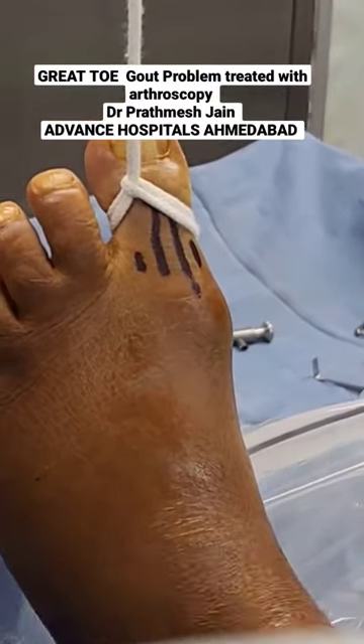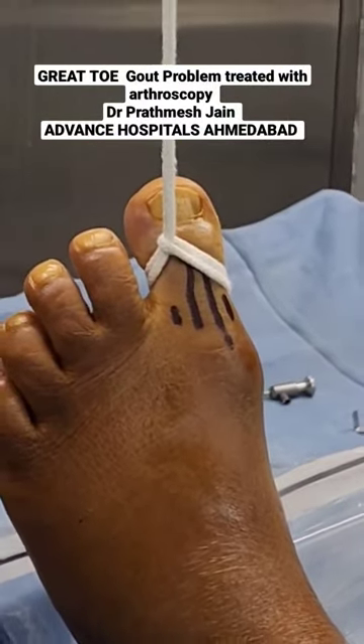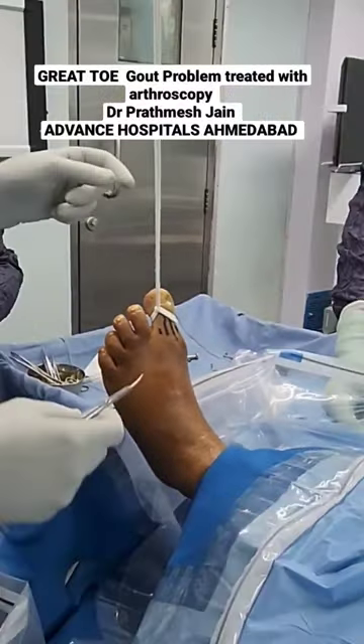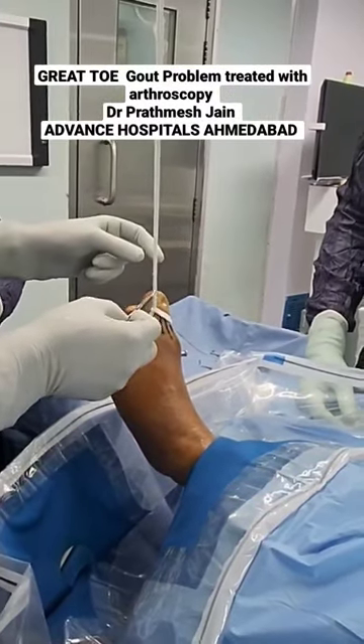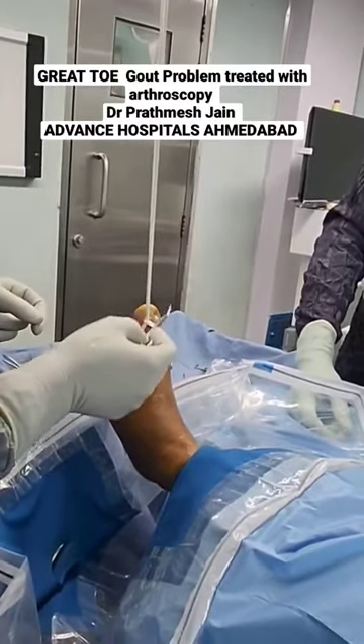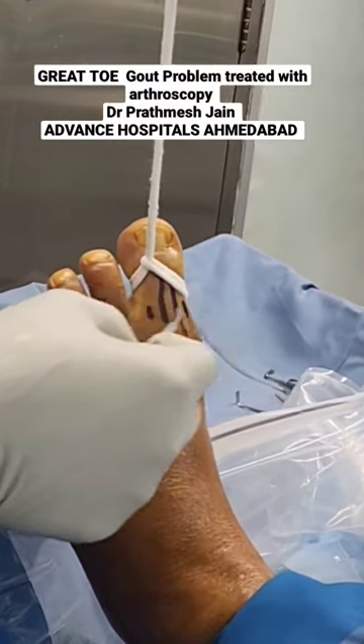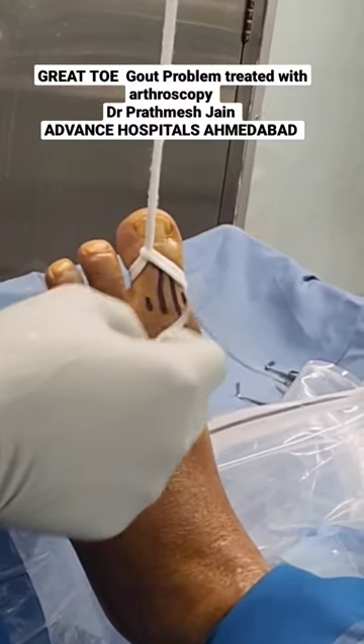This is our positioning. The patient is positioned in a supine position. There is a counter traction at this level, and there is basically a strong thread which is tying with the traction up. So the great toe is in traction, and at this point we will be able to make portals here in this spot.